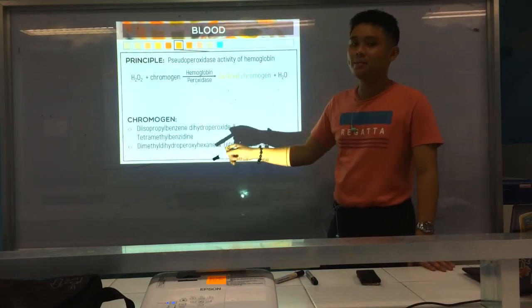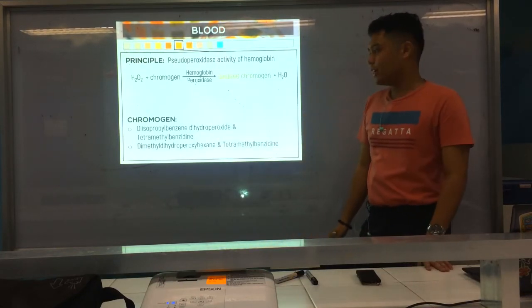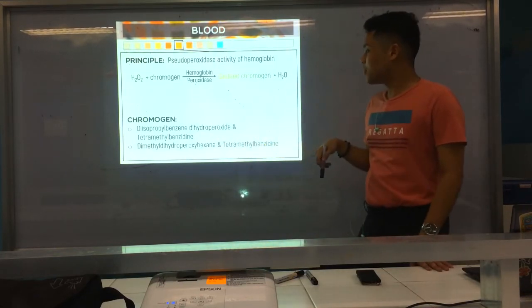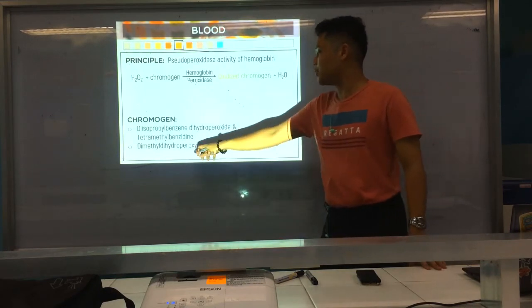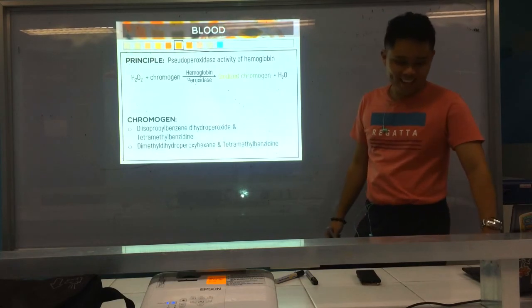Tetramethylbenzidine, tetramethylbenzidine. Basta ganin na tetramethylbenzidine, then that's probably blood. Okay? I think muna ako pag-remember. Or I think dihydro, blood yan. Okay, alright.